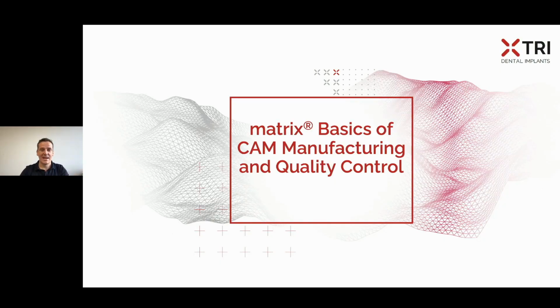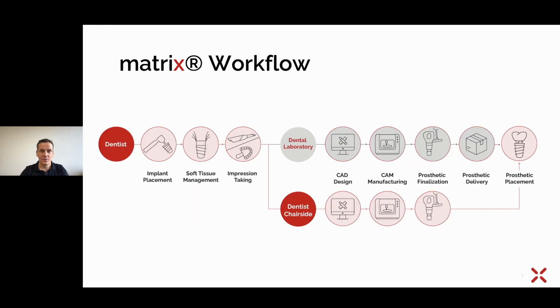Welcome to the class Matrix Basics of CAM Manufacturing and Quality Control. In the Matrix workflow, we are now at CAM Manufacturing. This can be done chairside at the dentist's office itself, and in laboratories or milling centers.